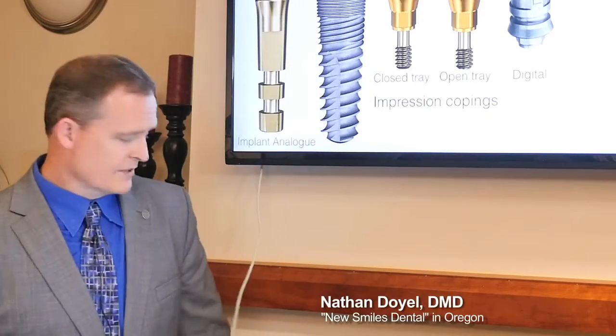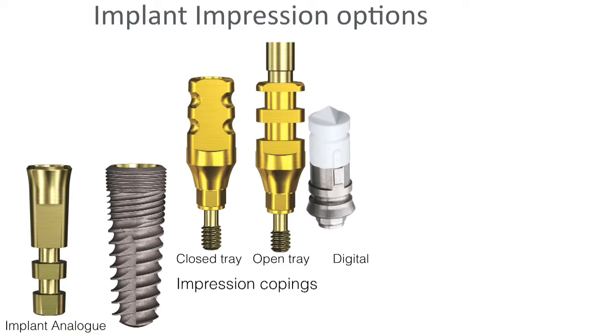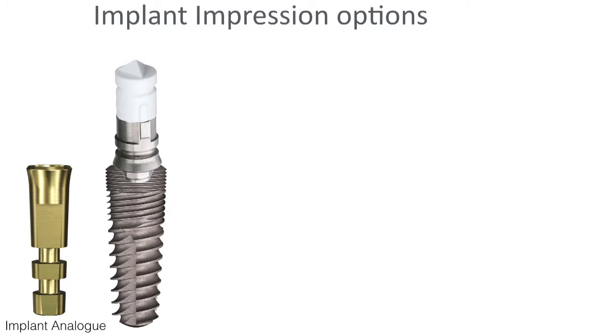All right, last thing I do most of the time now is I do digital. I'm mostly a digital kind of guy. You put on this scan body on top of a scan post that's placed on the implant, and then you scan it digitally. This is an example of, I think this is a CEREC, obviously.